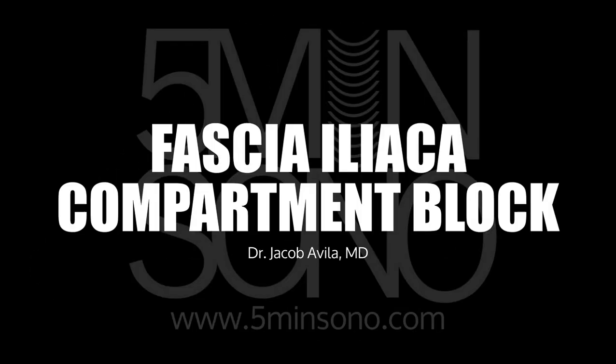Hello, my name is Jacob Avila and today I'm going to teach you how to do a fascia iliaca compartment block.